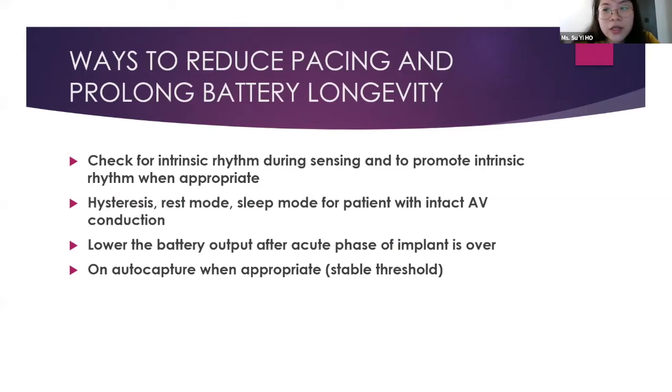We should also try to reduce unnecessary pacing and promote intrinsic rhythm for patients with intact AV conduction. So before any check, I'll also ensure that the AV delay is appropriately stretched for those with intact AV conduction, such as switching on the hysteresis, rest mode or sleep mode to customize it. Lowering the battery output after the acute phase of implant is over is also useful in extending the battery longevity.